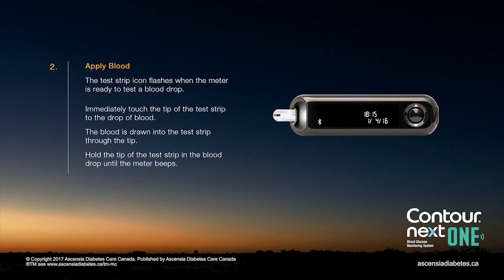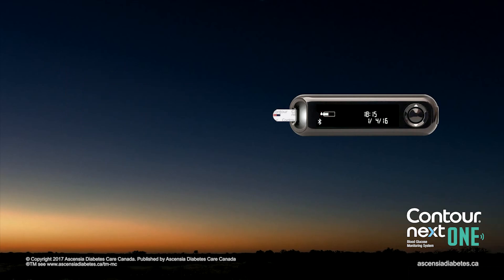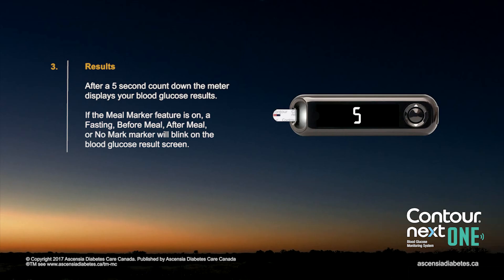Immediately touch the tip of the test strip to the drop of blood. The blood is drawn into the test strip through the tip. The meter will beep once complete. After a five-second countdown, the meter displays your blood glucose result.